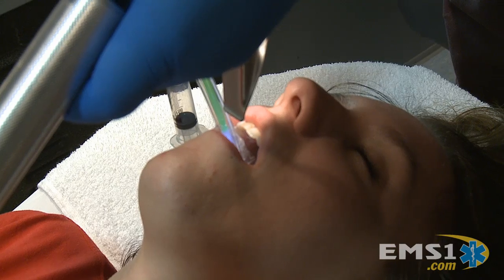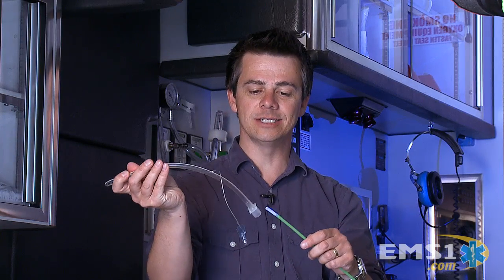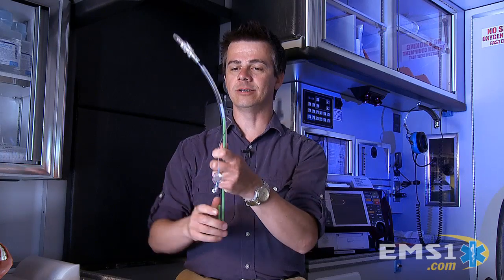You just take it just like a normal glow stick — you break it and you shake it. It's that simple. Now the Omniglow Corporation has told me that this won't break in the patient's mouth, and this along with the endotracheal tube is like two layers of protection.